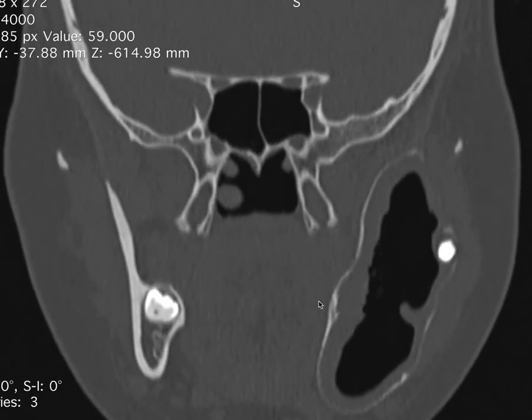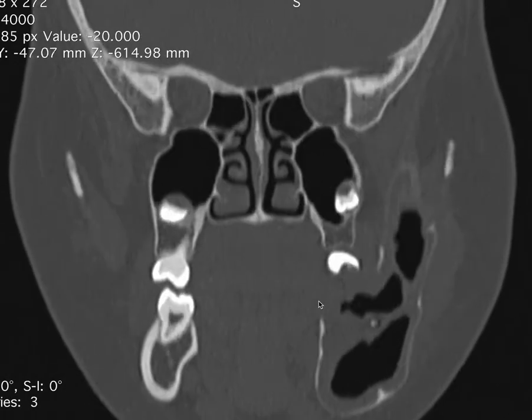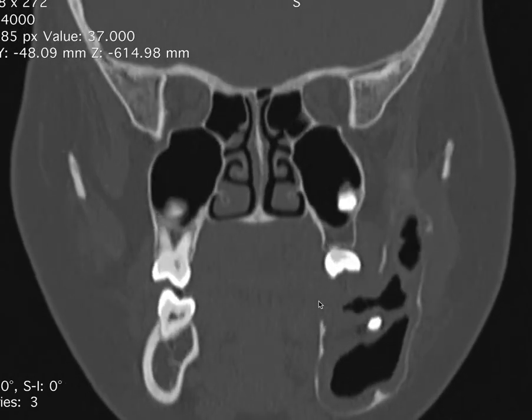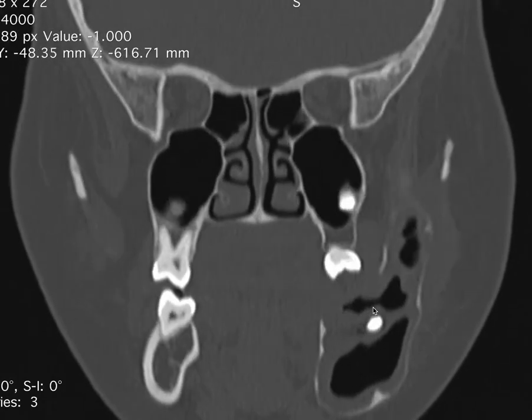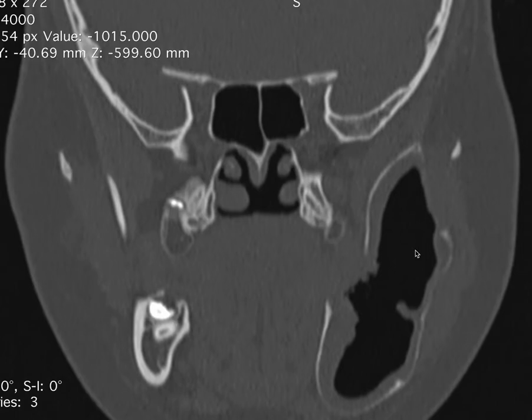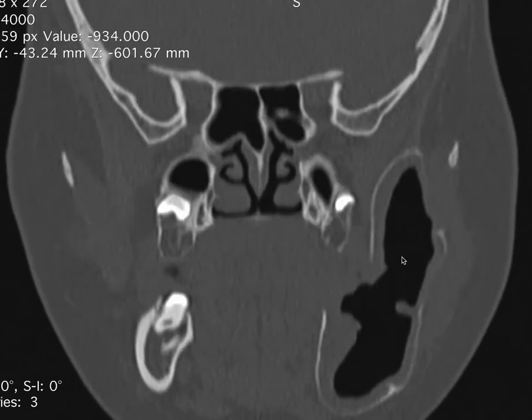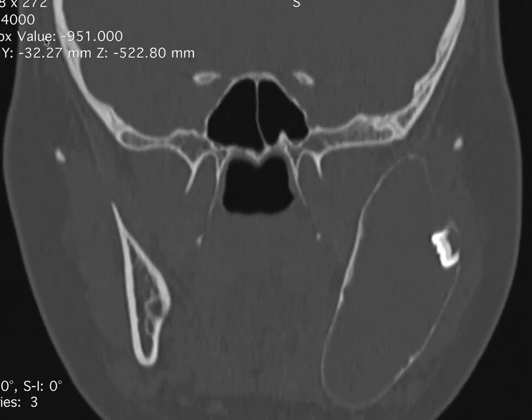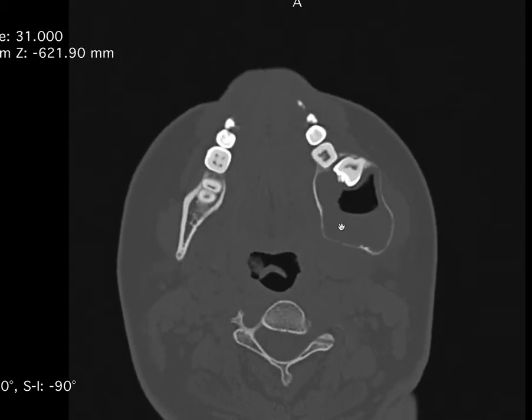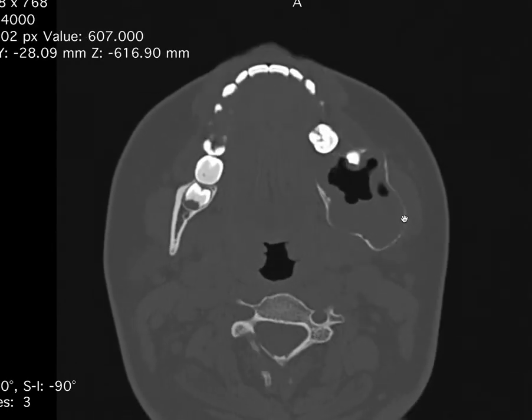There is a large, well-defined expansile lesion involving the body and ramus of the mandible with breach in the lingual cortex, most probably attributed to biopsy-related changes. Unerupted molar teeth are noted within the lesion. Soft tissue component and fluid levels are noted within the lesion. Axial CT image showing the delineation of the lesion, with thinning and scalloping of the cortex.